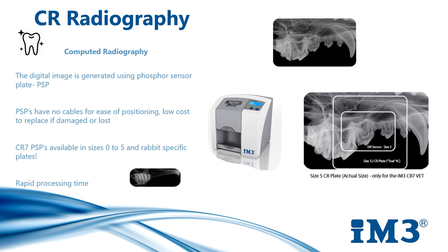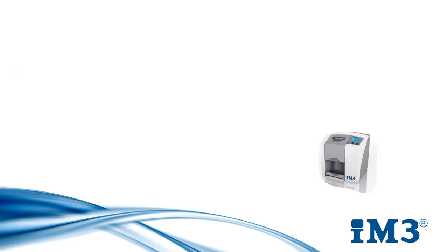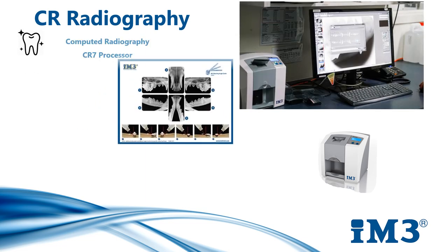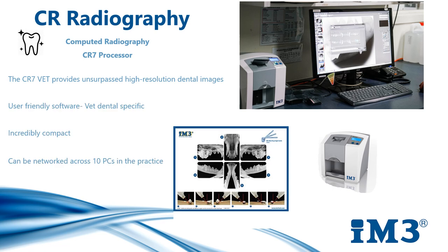In addition to these plates, we also have high resolution rabbit-specific plates for intraoral imaging. Best practice is to take full mouth x-rays for all patients undergoing a dental procedure. The CRVET provides unsurpassed high resolution dental images and uses veterinary dental-specific software. As it's nice and compact, it sits perfectly next to a computer or laptop in your dental area or suite, and the software can also be networked across 10 PCs in your practice.